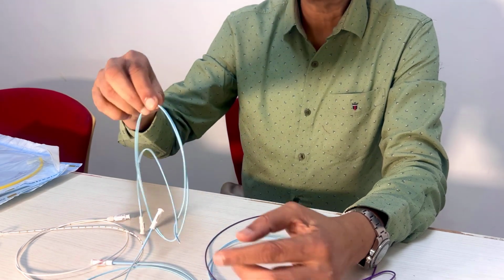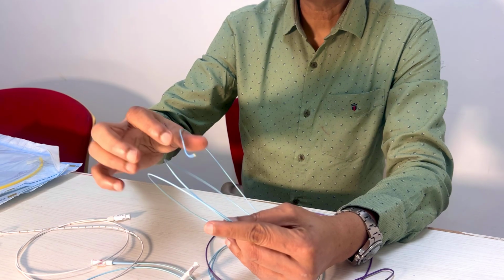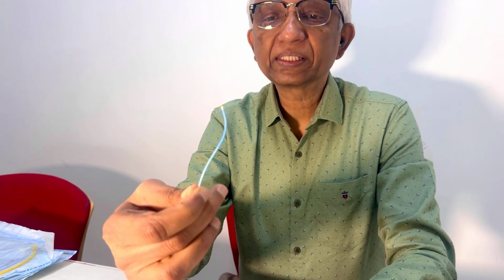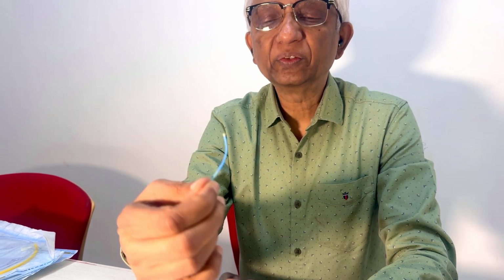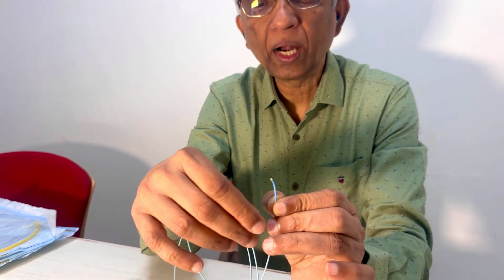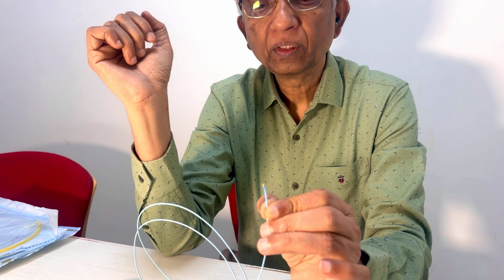So for example, you're working with a catheter, and this technically is a multi-purpose catheter. Can you see the curve? Multi-purpose catheter is just a name. In honest reality, we don't use these catheters often. Now, also in a catheter, it's very important to see the tip. If we can zoom closer, you will notice these catheters have just one hole at the tip. Okay, just one hole at the tip, right?